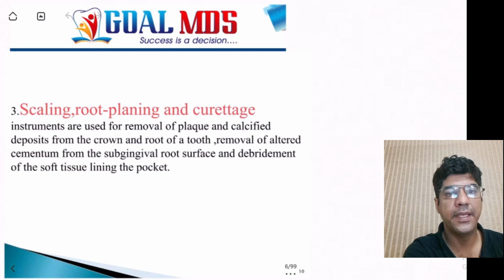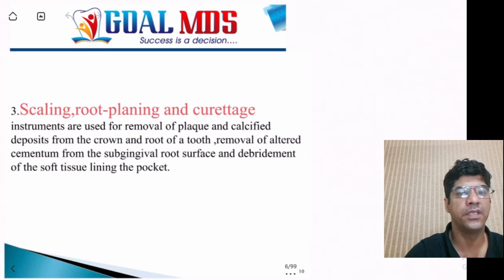The scaling and root planing instruments are used to remove plaque and calculus deposits from the crowns and the roots of the tooth. What are the classifications?